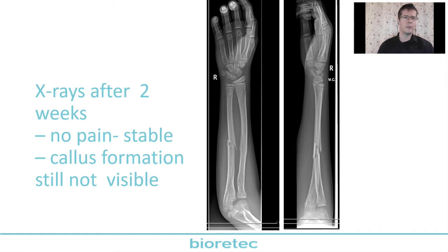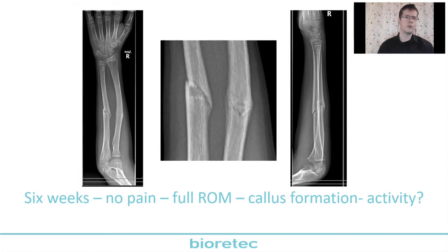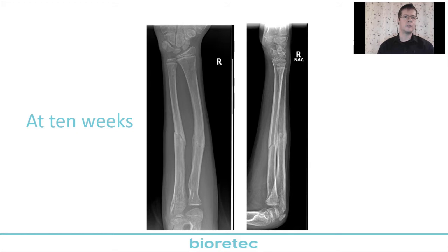Of course, she was very careful. Next slide, please. And there was no problem with this. We can see a moderate callus formation after 6 weeks. Next slide, please. And here we can see the pictures at 10 weeks, a very impressive bone healing.